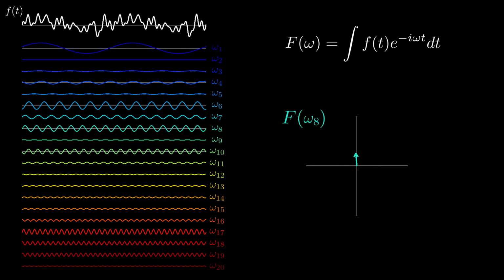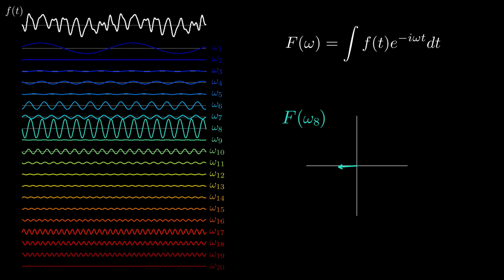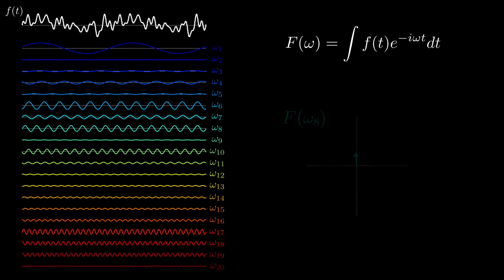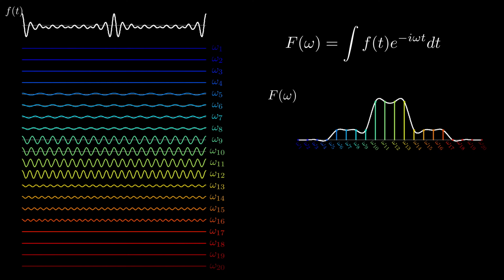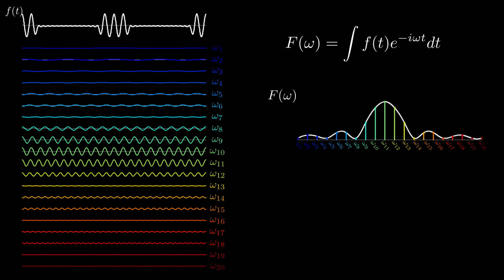in turn described by a single complex number called a phasor, which mathematically scales its sinusoid amplitude and shifts the sinusoid's phase. The Fourier transform is the operation which gives you the phasors big F of omega associated with every frequency omega, such that they are represented in the original measured signal. So the concept of the gradient echo is actually fairly simple.